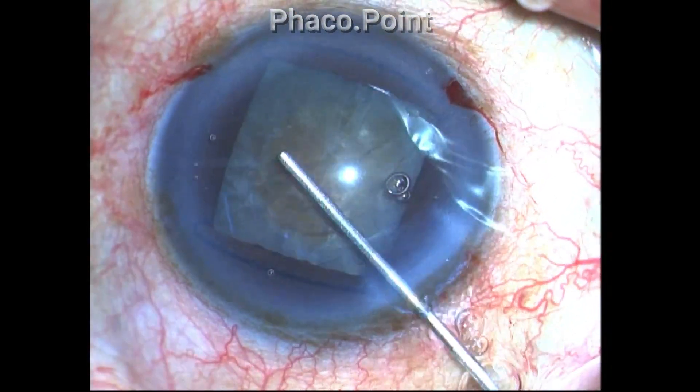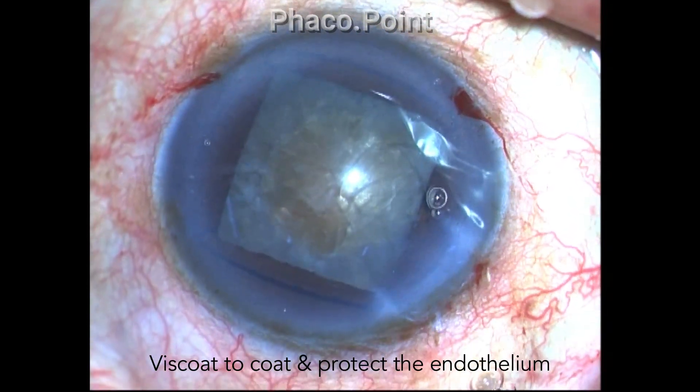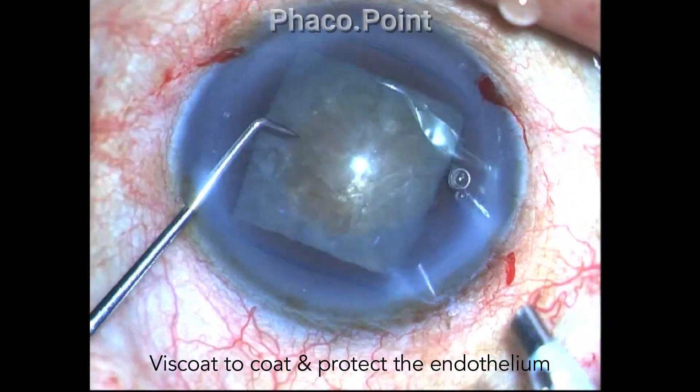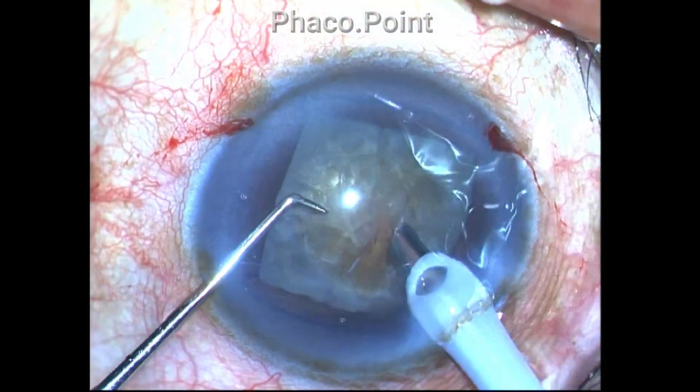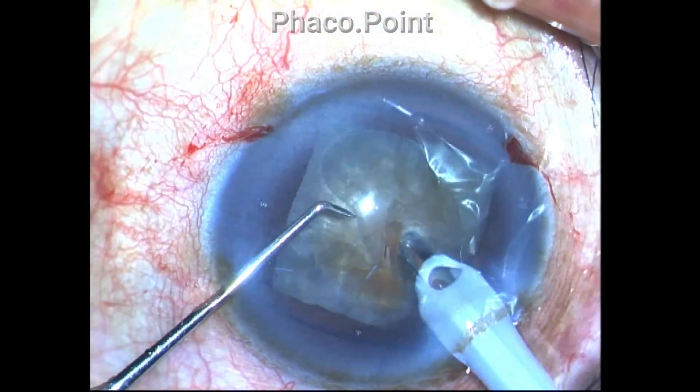Viscoat is then placed to coat the corneal endothelium and to protect it from the phaco energy as well as flying shrapnel that gets released during the process of phacoemulsification.